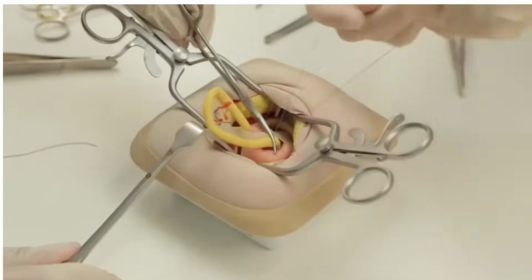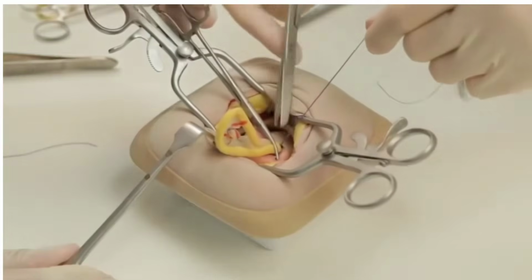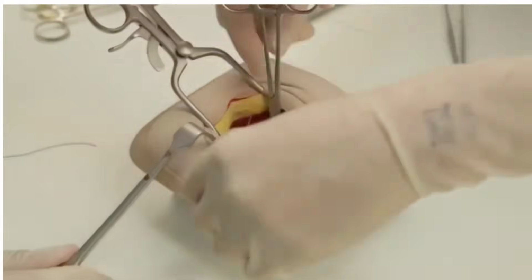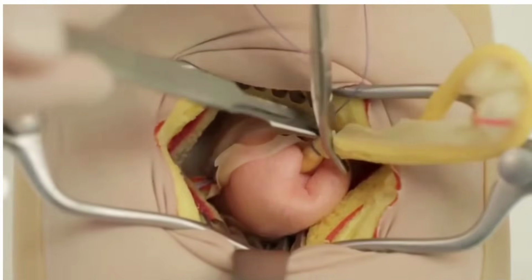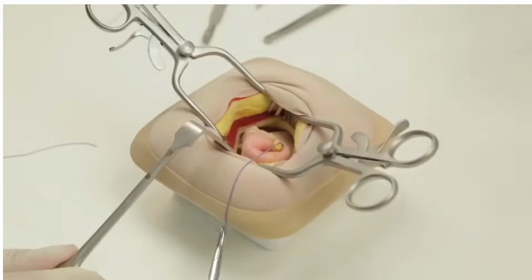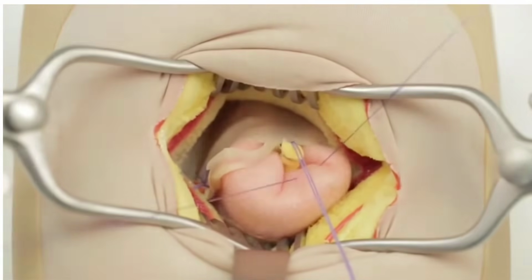The stump can be managed in 2 ways. Simple ligation with the stump left exposed is common. Alternatively, it may be inverted into the cecum with a purse string or Z suture placed in the cecal wall. Choose the method according to surgeon preference and intraoperative findings.